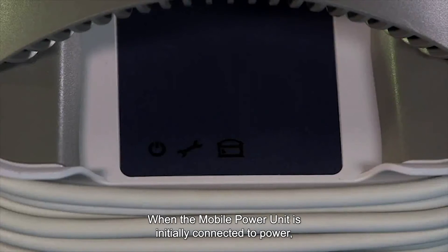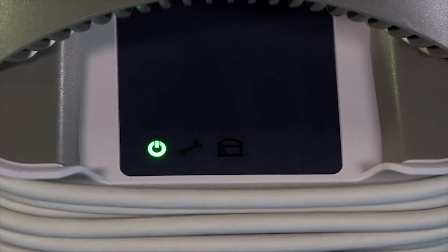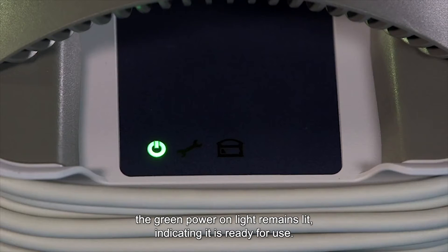When the mobile power unit is initially connected to power, it automatically performs a self-test. At the completion of the self-test, the green power on light remains lit, indicating it is ready for use.